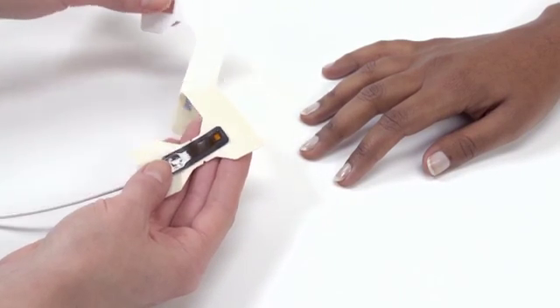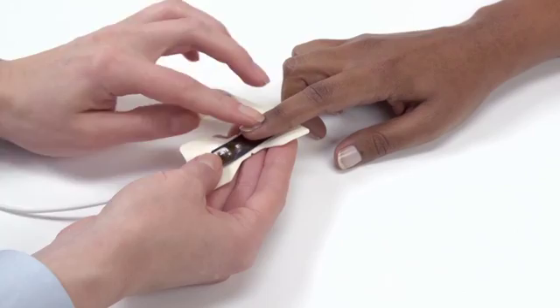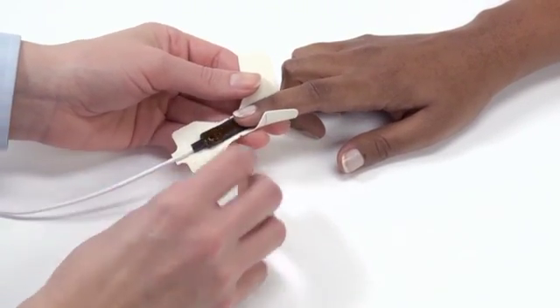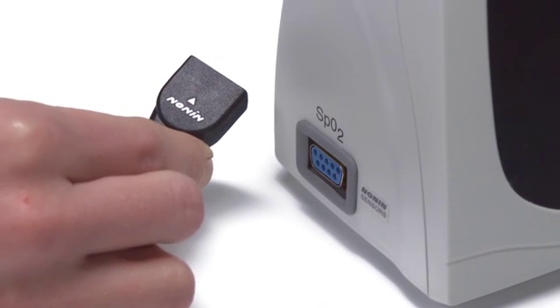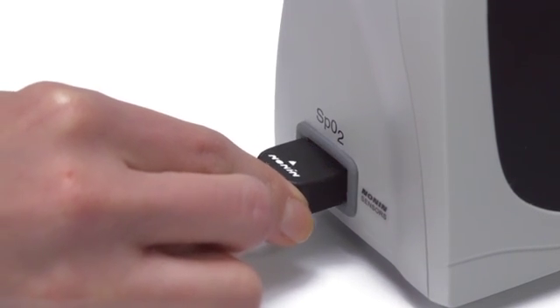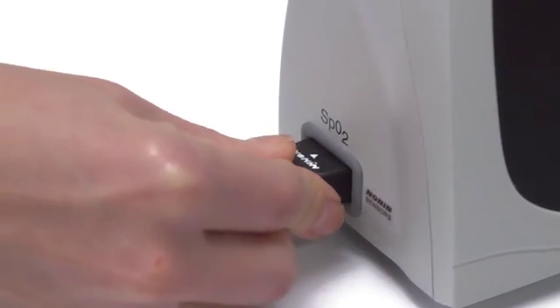Prepare and place the sensor on the patient prior to connecting it to the oximeter. Proper sensor placement is critical for accurate readings. Follow the instructions for each sensor type to ensure secure, aligned positioning of the sensor on the finger or skin surface. Connect the sensor to the pulse oximeter by inserting the plug with the Nonin logo visible from the front into the left side of the unit. The connector should firmly seat in the connector port on the oximeter.